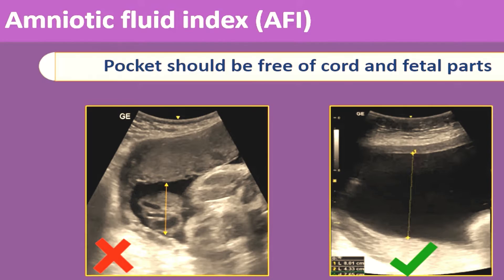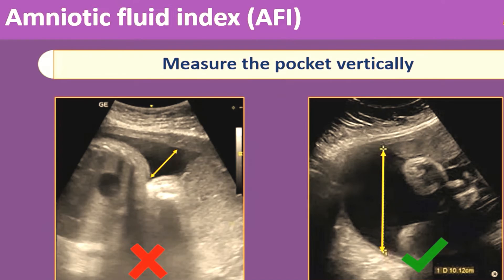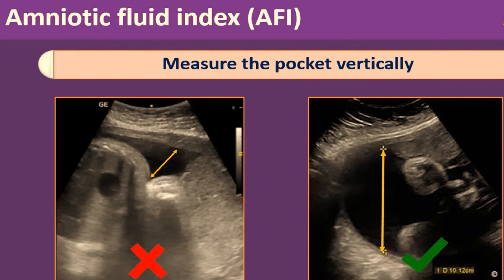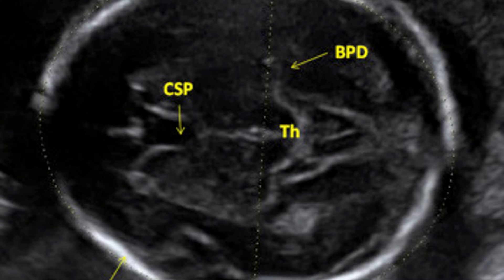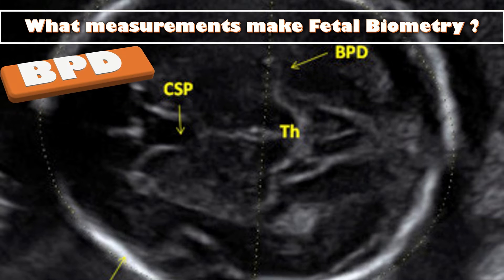Always measure the pocket vertically. After measuring the amniotic fluid volume, it is very important to also perform fetal biometry, in which fetal measurements are obtained using different ultrasound parameters.